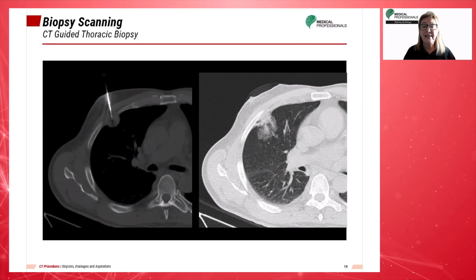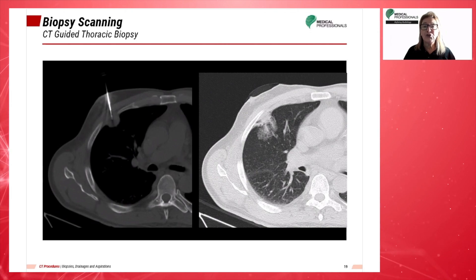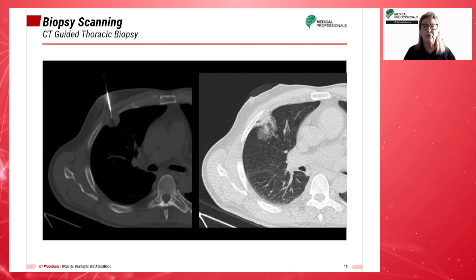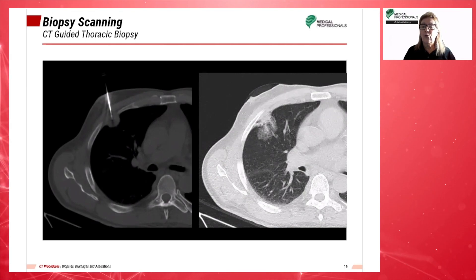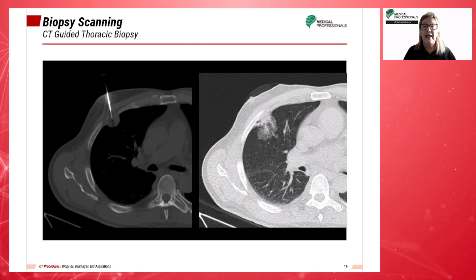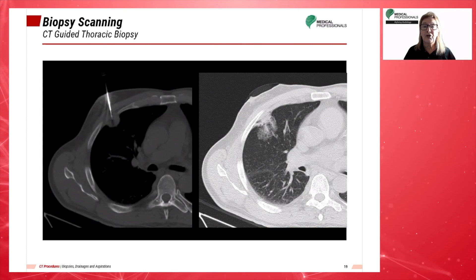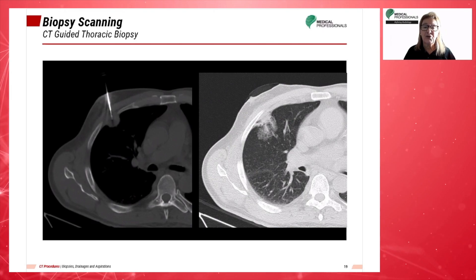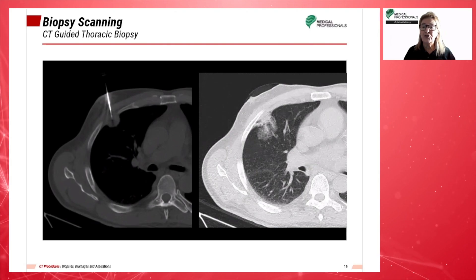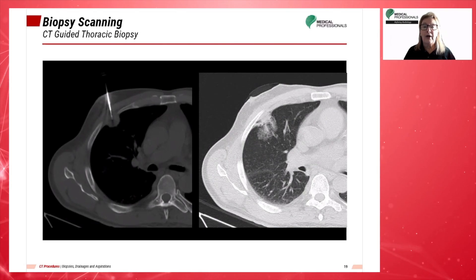A CT-guided thoracic biopsy is usually performed for the diagnosis of suspicious lung, pleural, or mediastinal lesions. It can be performed as an outpatient procedure where patient monitoring and complication support are available. A small percentage of lung and pleural biopsies may be performed under ultrasound guidance in specific circumstances. The most common complication of CT-guided lung biopsy is the occurrence of pneumothorax during or after the intervention.